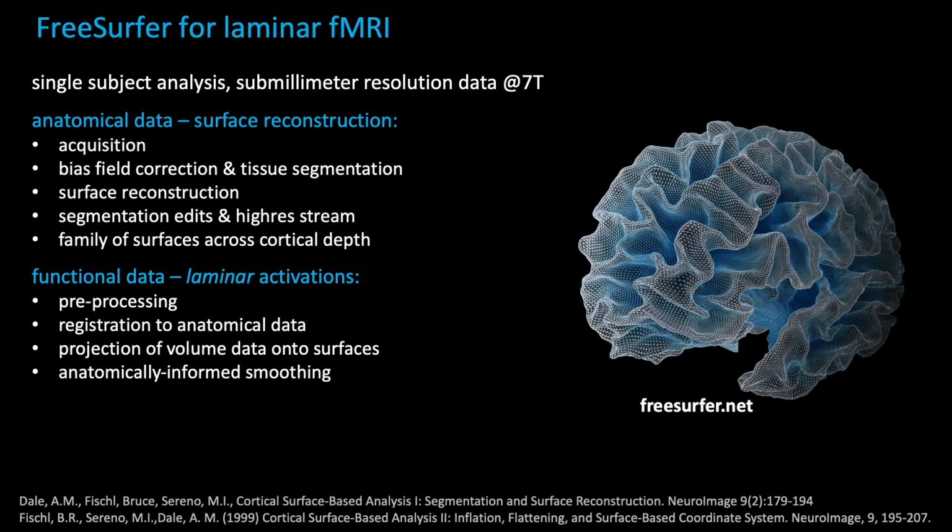And finally, I'm going to show you our anatomically informed smoothing method. And we're going to finish with the overview of the scripts, which we'll be using tomorrow if you decide to learn a little bit more about this pipeline.